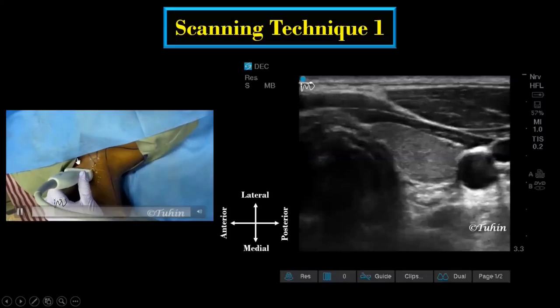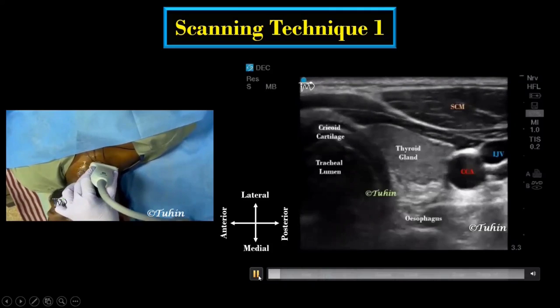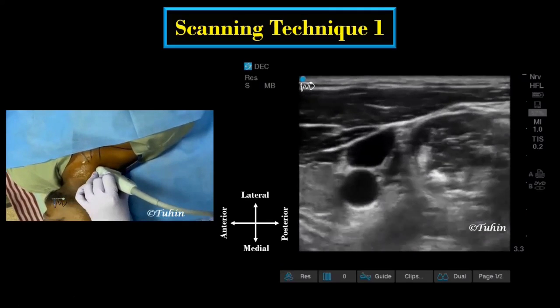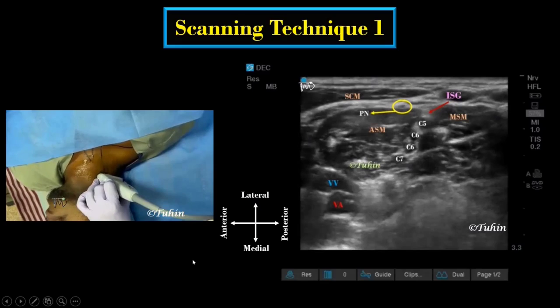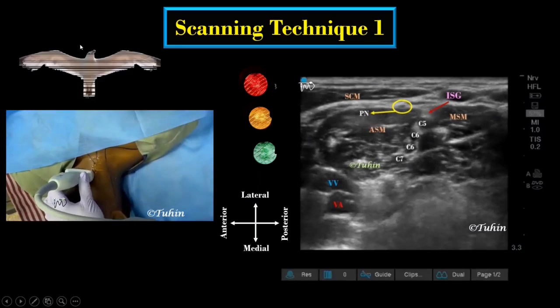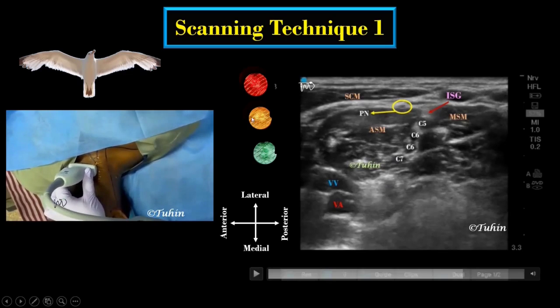In this technique, the scanning starts at or just below the level of the cricoid cartilage and medial to the sternocleidomastoid muscle, with a goal to identify the carotid artery laterally. The transducer is then moved laterally across the neck to identify the anterior scalene muscle, middle scalene muscle, and the elements of the brachial plexus in between them. It appears as the traffic light or stoplight pattern — also called the seagull sign — where the brachial plexus elements form the head, body, and tail of the seagull, while the scalene muscles form the wings.